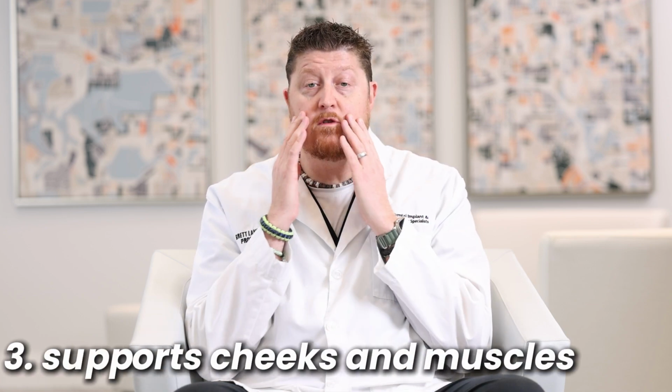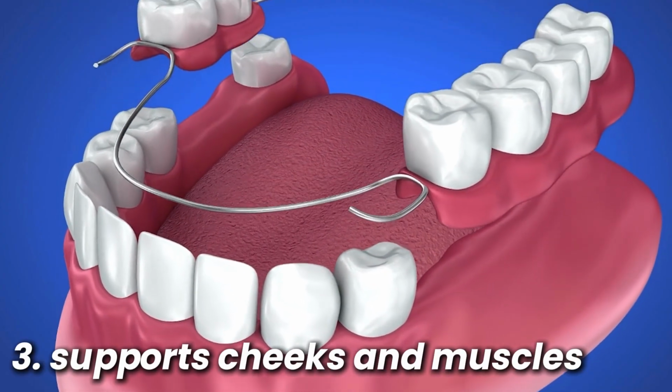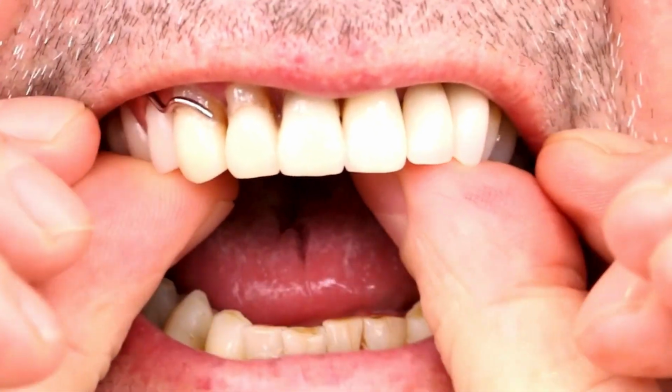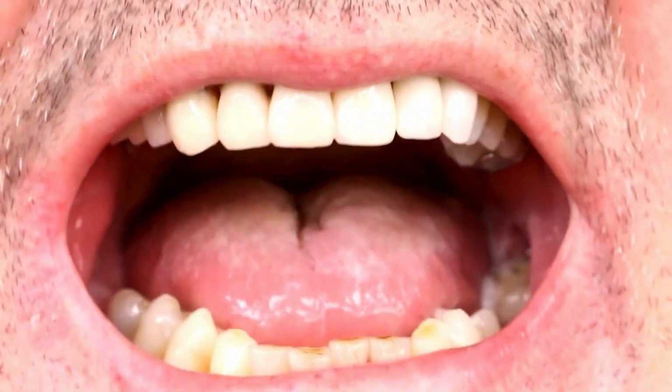The third thing that a properly fitting denture does is it actually supports your cheeks and your muscles. Not only does it stay in place to provide more fullness to your face, it also allows you to have a natural-looking smile and natural profile. One thing you'll notice is that a lot of times when you don't have a denture in and you've lost all those teeth, you have a really collapsed mid-face. It's a very unaesthetic, very common look for someone without teeth. A nice fitting set of dentures fills out the lower mouth and gives you a more natural appearance and profile.